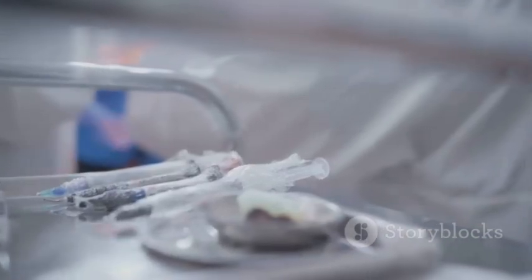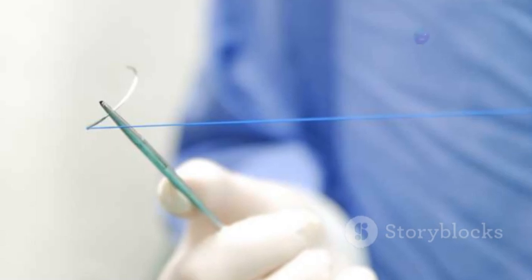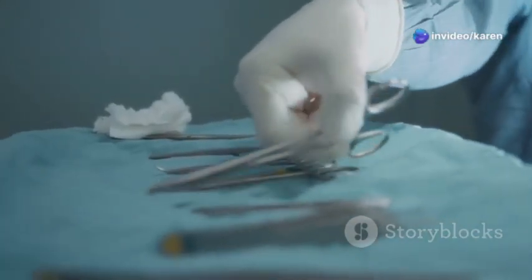Needles also come in various shapes and sizes. This includes cutting needles for tough tissues. Round needles are for softer tissues. The choice of needle depends on the tissue being sutured and the surgeon's preference.